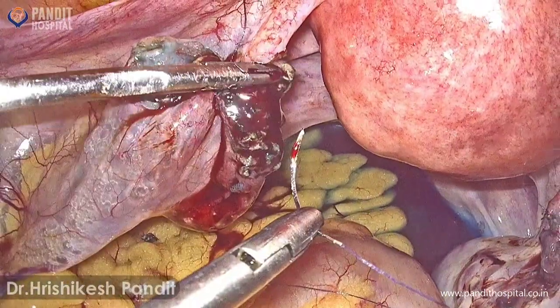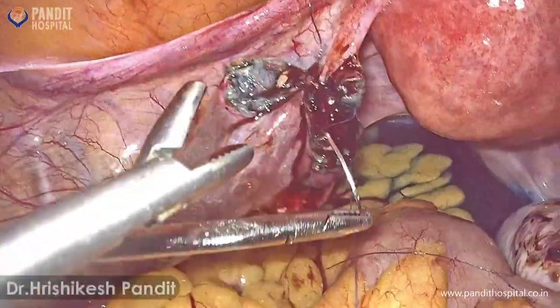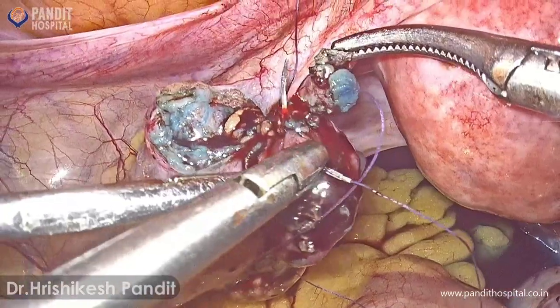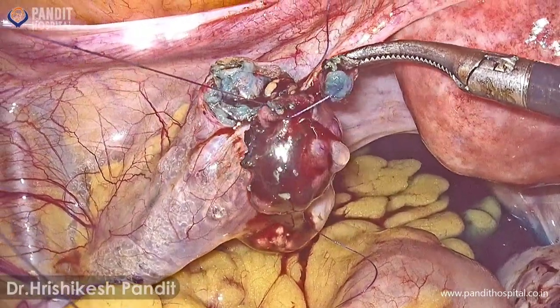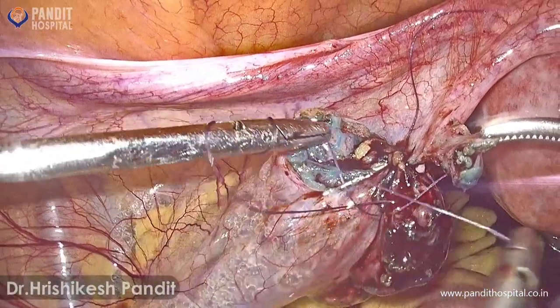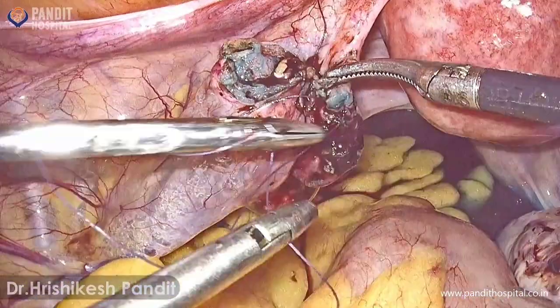There is some bleeding so I am not able to visualize the mucosa of the distal end, but I am able to visualize the mucosa of the proximal end, so I pierce through the 6 o'clock position and then pierce through the distal end through the mucosa. There is definitely going to be a mucosal mismatch of proximal and distal end, but we are trying to give the best anastomosis of the tubes from our side.